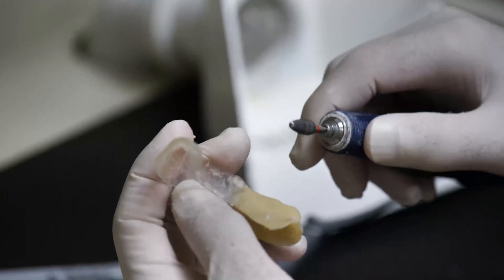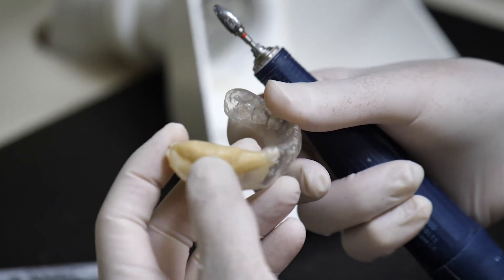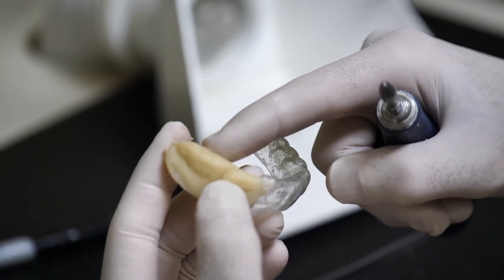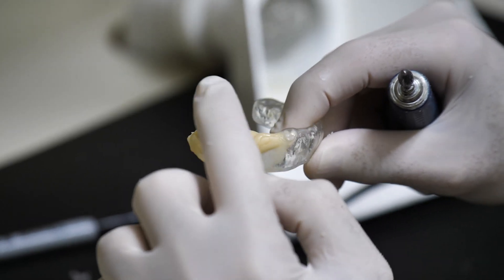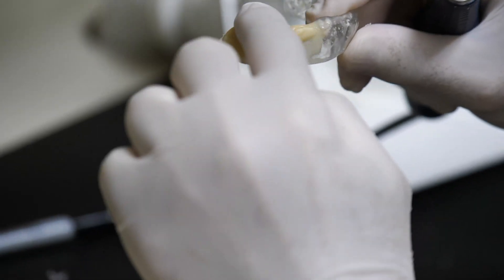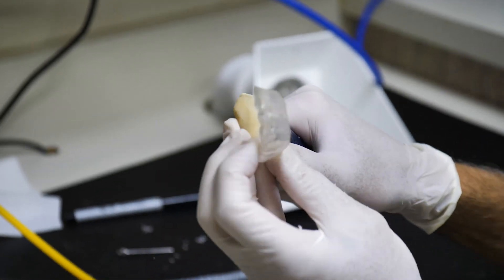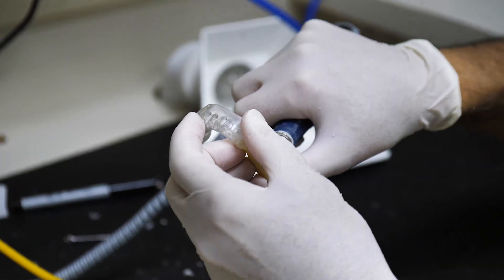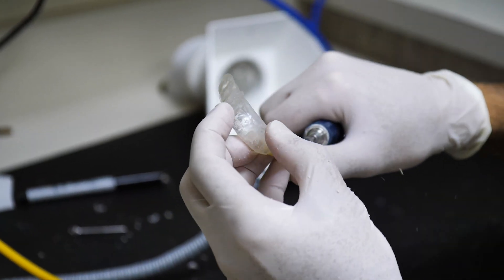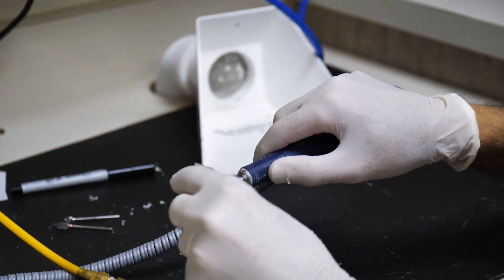The white acrylic is trimmed, built up, and it's slightly short of the occlusion because we don't want him to chew very heavily on this side — so that we don't get a sinking effect which would bang on the implant every time he ate. This is made of 60-thickness Essix material and was made over a study model before we placed the implants. He has to wear this 24/7 for at least two months.